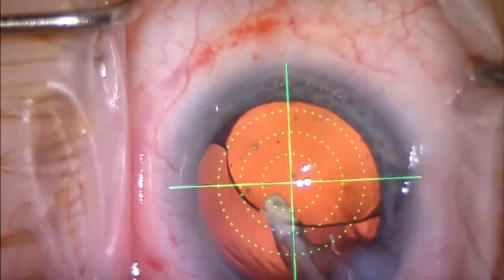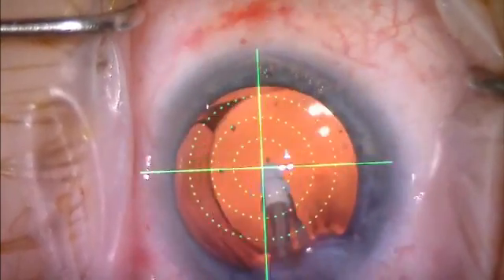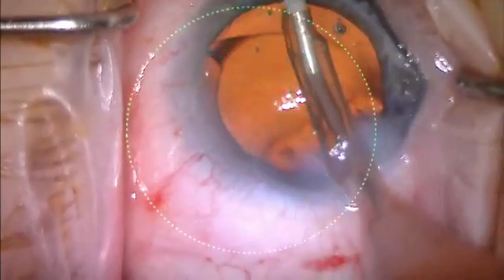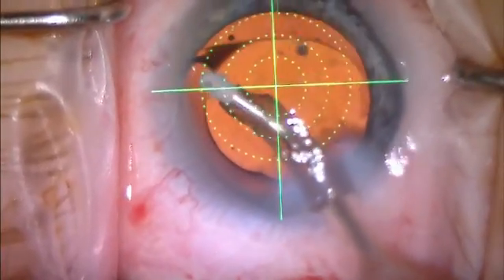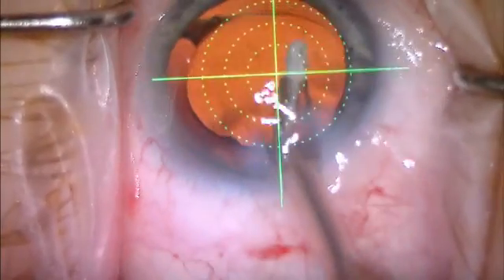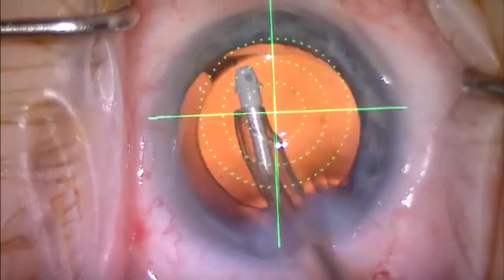So upon removing viscoelastic, as we're doing now, I like to go below the intraocular lens and remove as much of the viscoelastic as possible. This helps in terms of being able to place the lens where we would like, due to the tackiness of the acrylic material and its adherence to the posterior capsule.